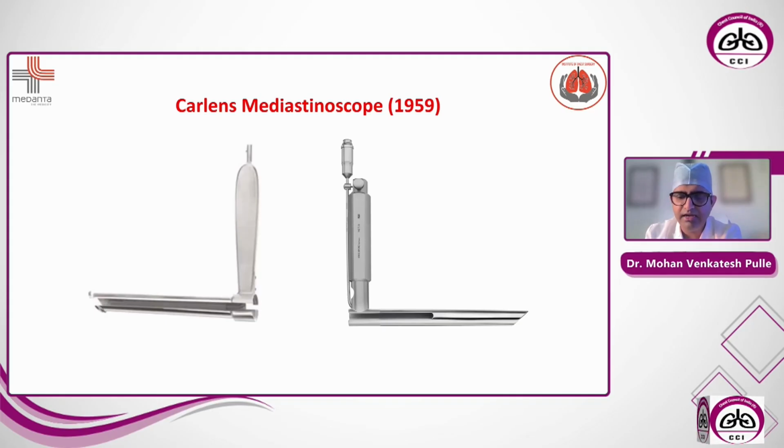The mediastinoscope was invented in the late 1950s, when many futile thoracotomies were happening for lung cancer. As soon as they went inside, they found it very highly advanced. To prevent those futile thoracotomies, people first put a laryngoscope into the mediastinum and sampled a few of the lymph nodes. But it was not a conventional mediastinoscopy until 1959, when Carlens started doing this mediastinoscopy by inventing this kind of instrument. This is how a mediastinoscope looks.